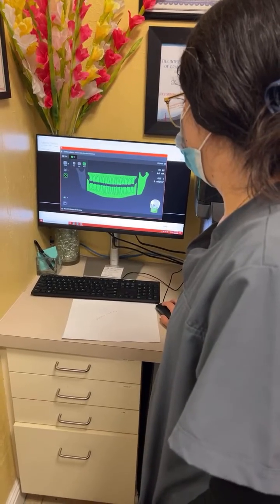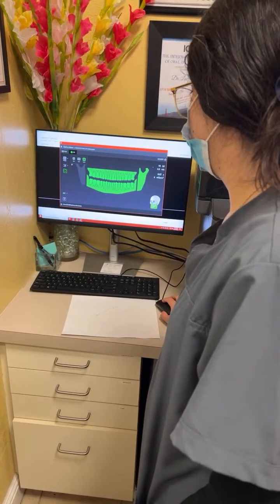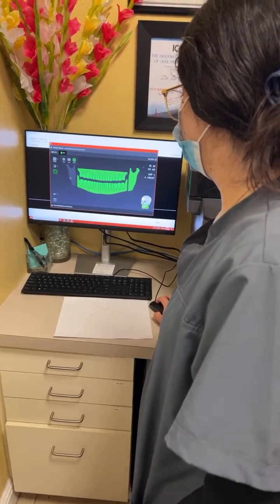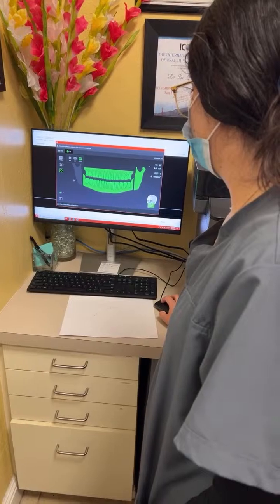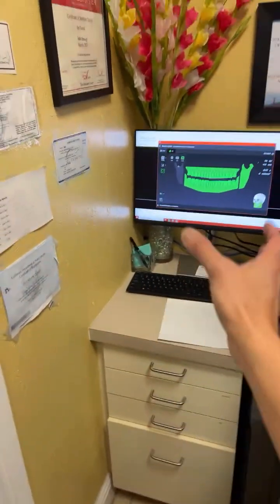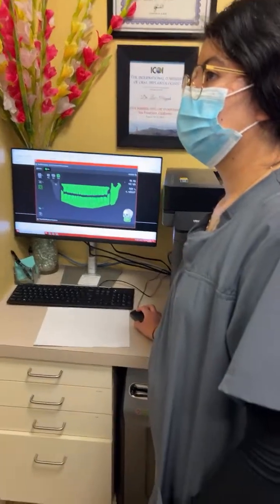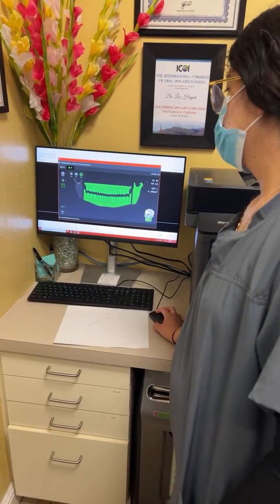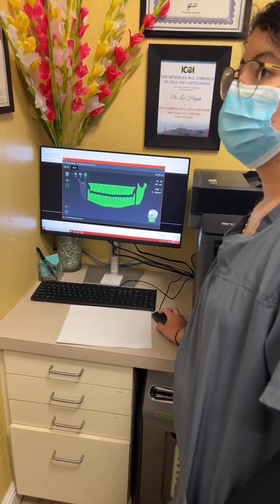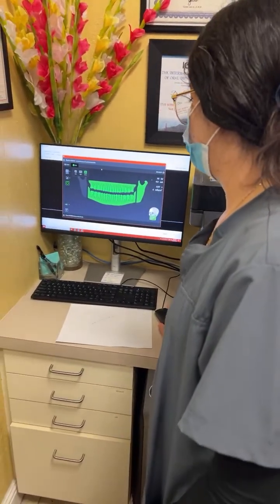Automatic select for you the bigger one. So I don't know which one you selected. The whole mount. Looks like he wants the whole mount. So 9x11. Larry, how do I take, let's say I get this, and then I want that one. Can a patient stay there, and then we just scan another part? You could. Do you know that you purchased the 9x14 or was it 9x11? I don't know. I have to look it up.